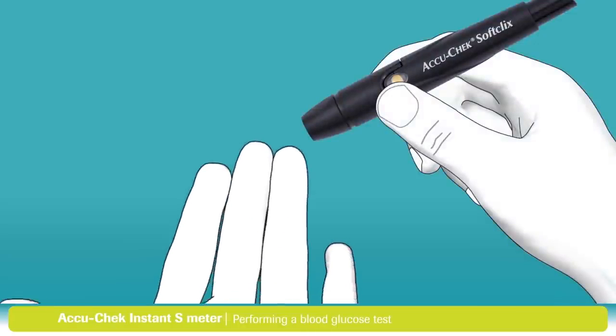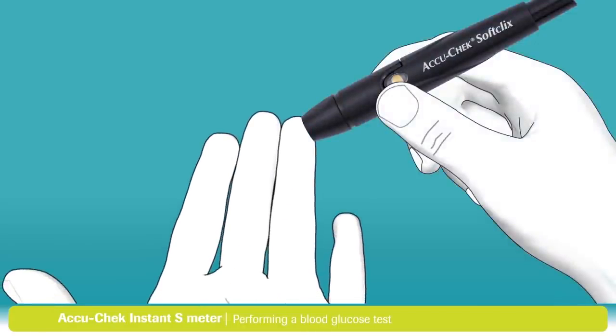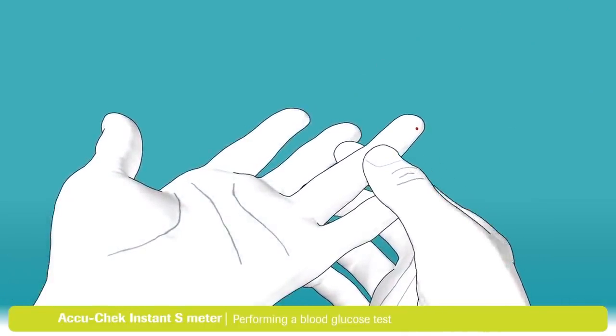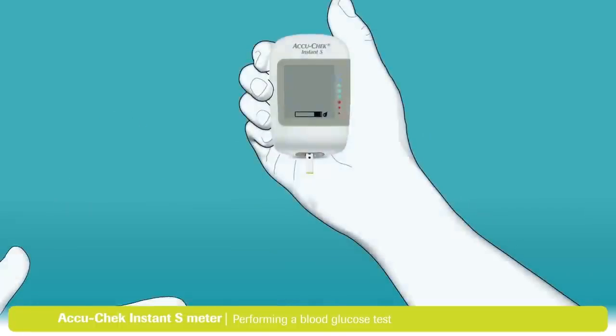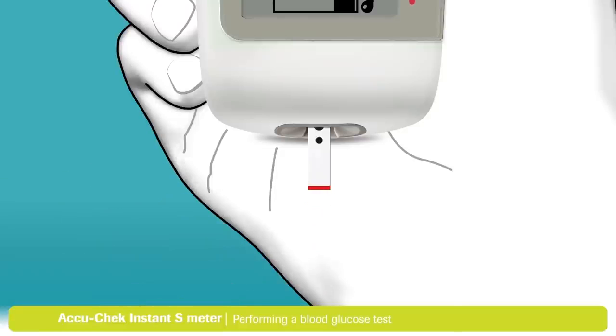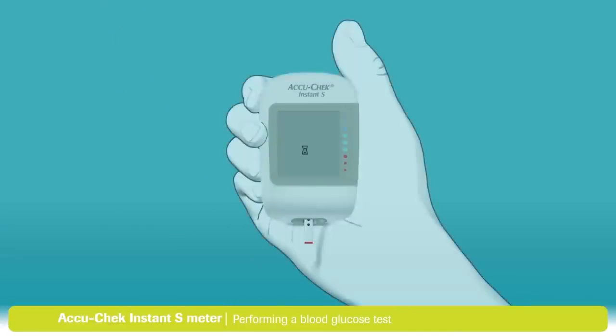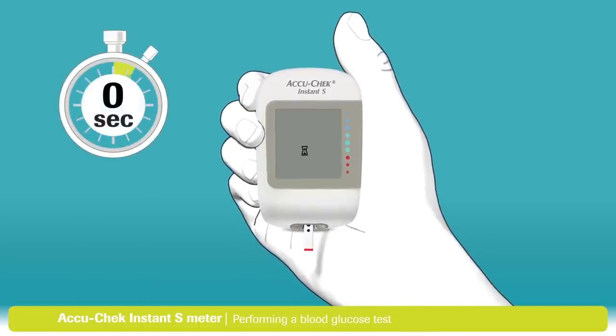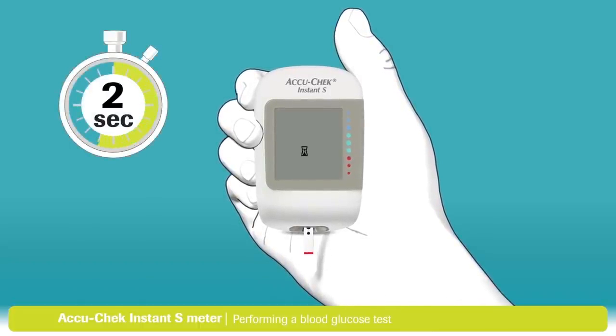Now it's time to use the lancing device. Place the pinhole opening firmly against your finger and press the yellow release button. This will lance your finger. Massage the finger in the direction of the fingertip to help the blood drop form. Touch the yellow edge of the test strip to the blood drop. This wide area for dosing makes it easy to fill with just a tiny drop.